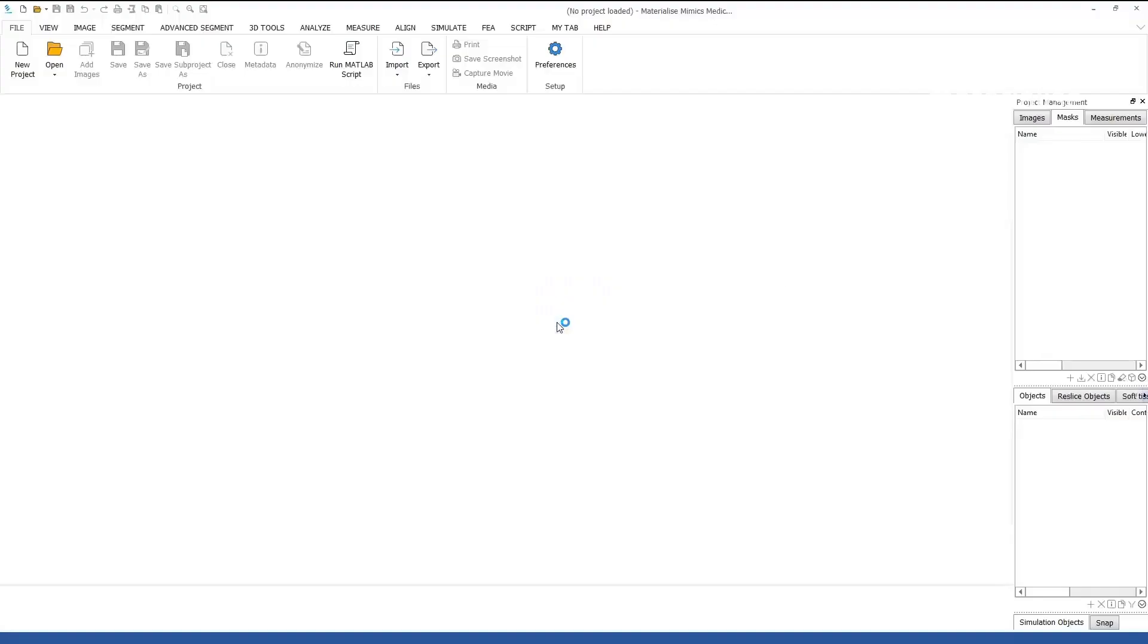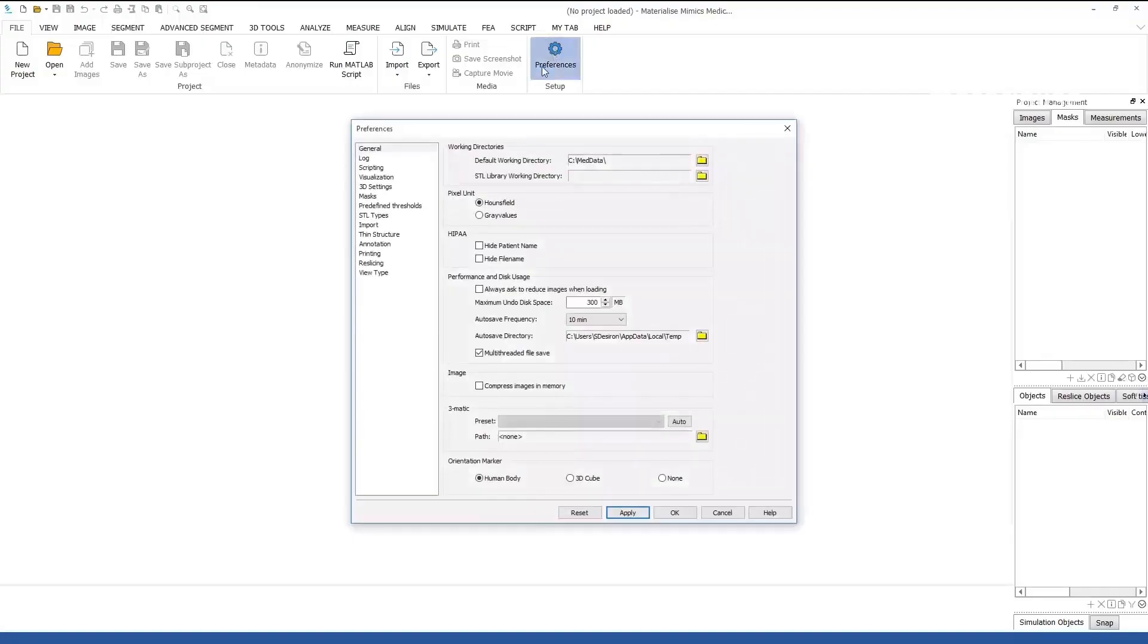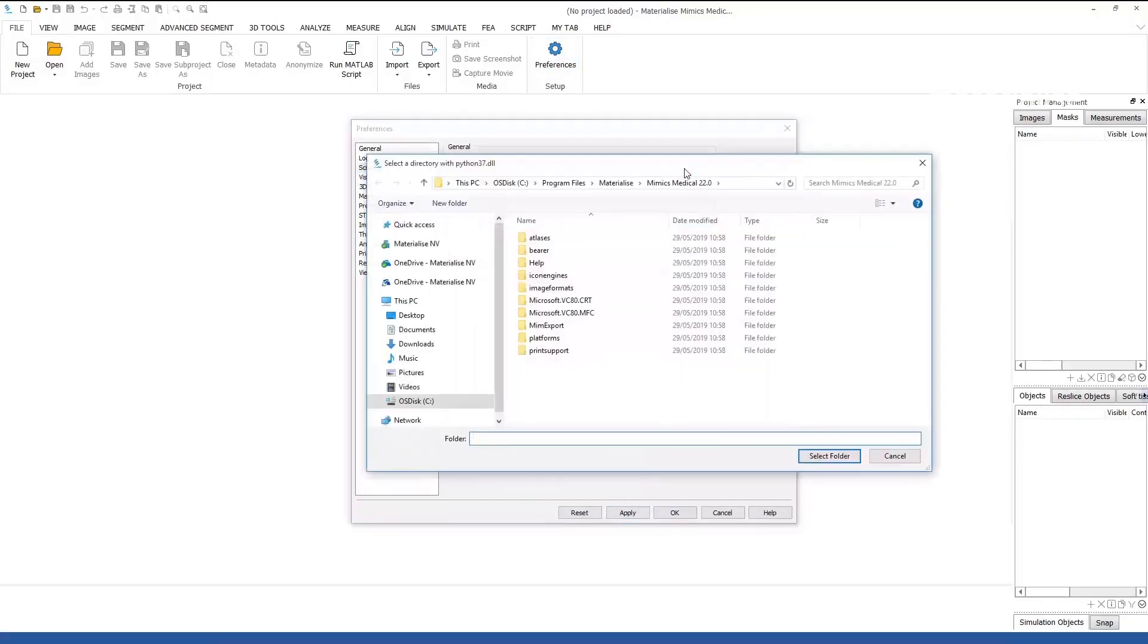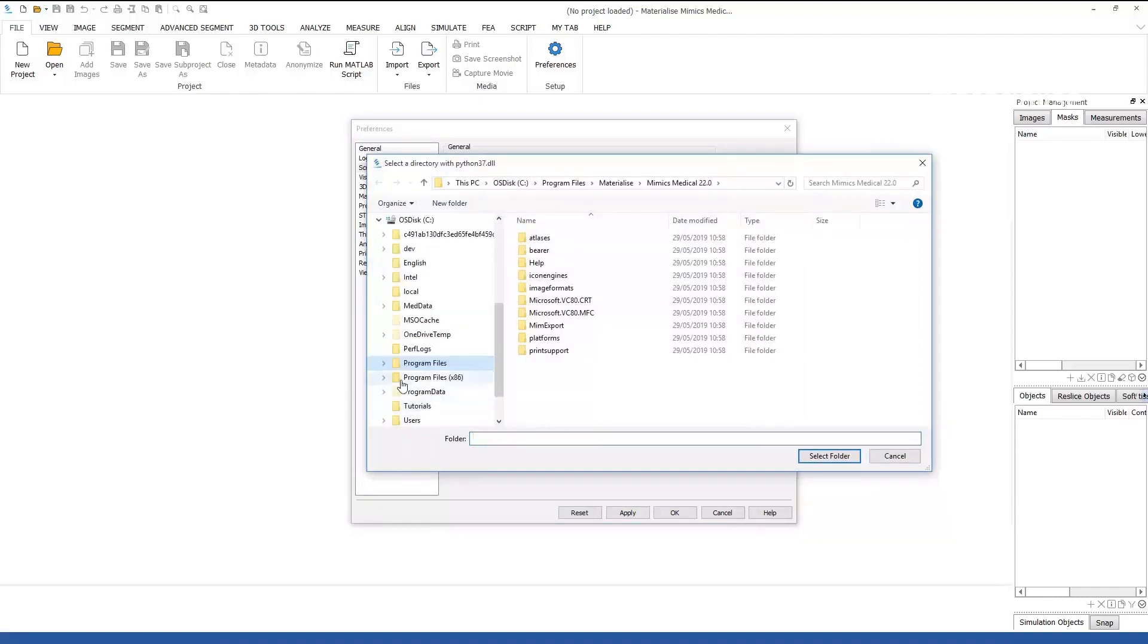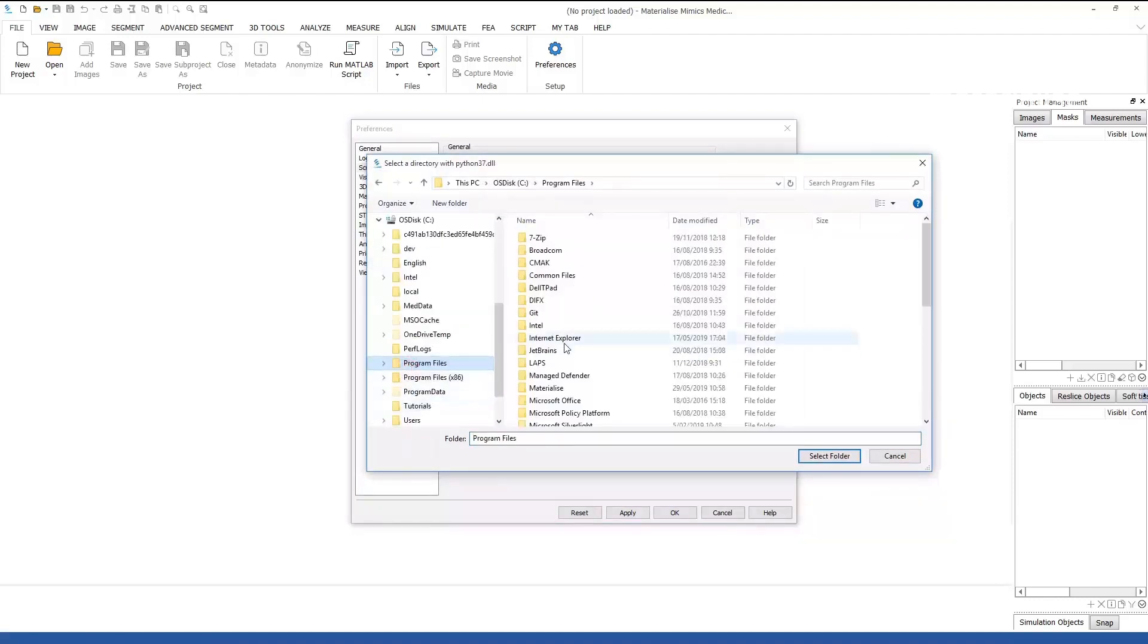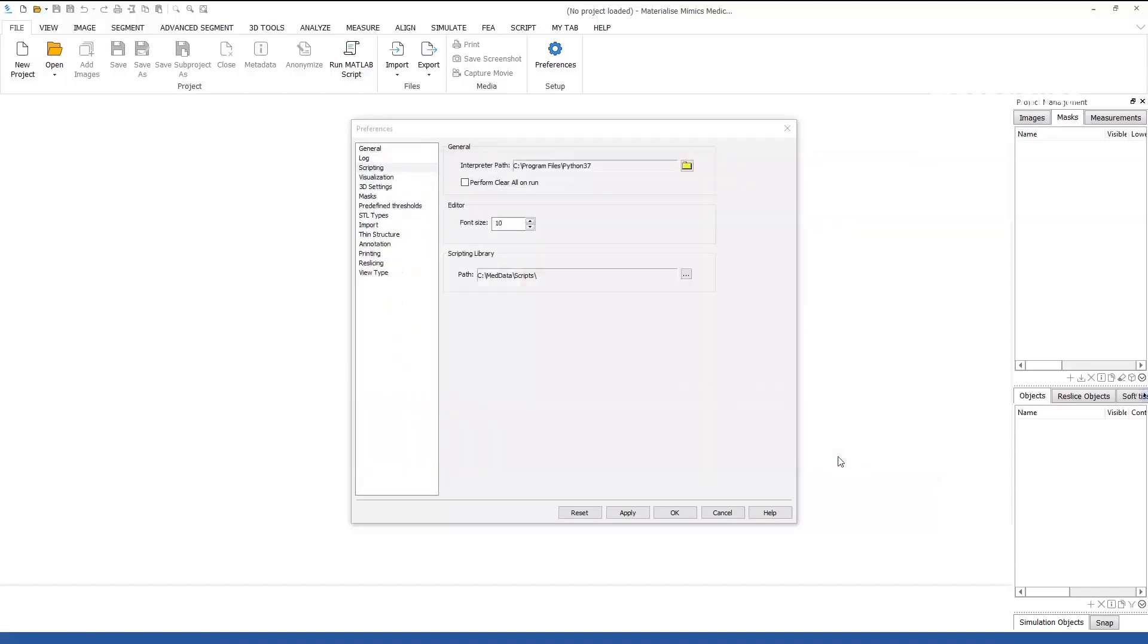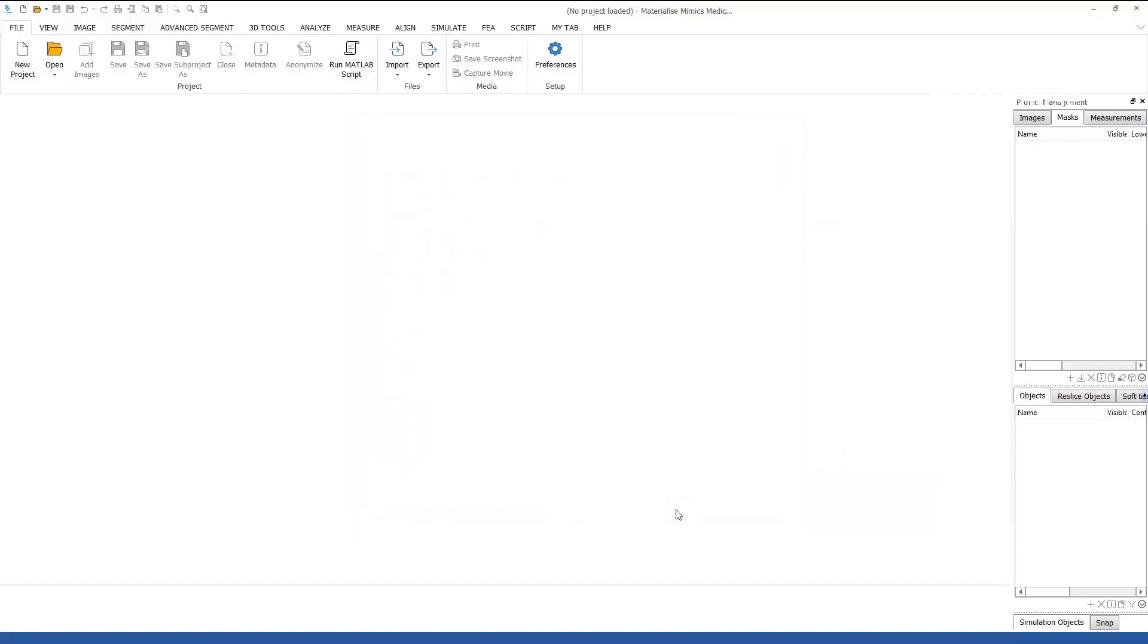The first step is to launch Mimics and go to the Preferences dialog. Switch to the Scripting tab and click on the Folder icon next to the Interpreter Path setting. Browse to the location of your Python installation and select the correct folder, which in this case is Python 3.7.